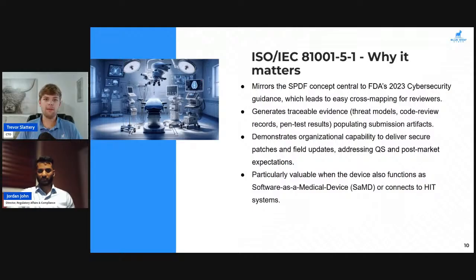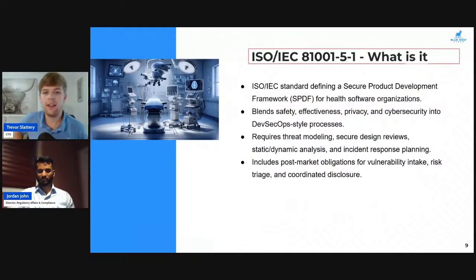Now, why does it matter? This goes right into that secure product development framework that is central to the FDA guidance. This is going to be easy traceability for any FDA reviewers. I'll go back for a second: threat modeling, secure design review, static and dynamic analysis, post-market obligations. All of these are direct obligations when submitting to the FDA now under the current guidance. So adhering to IEC 81001-5-1 oftentimes is going to build in all of the infrastructure, all of the systems and processes that you'll need to adhere to FDA compliance when it comes time for submission.